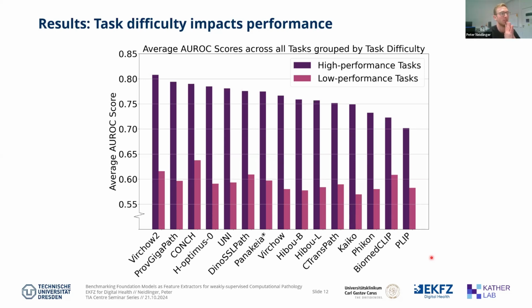It can be a variety of things. For some of the tasks, if the classes are very unbalanced and one group only has relatively few positive cases, that might lead to reduced performance. If you had more cases to train on, it might get better. But I excluded all tasks where there were fewer than 10 cases in the small class, to avoid tasks where there just aren't enough cases. But that might be one reason.